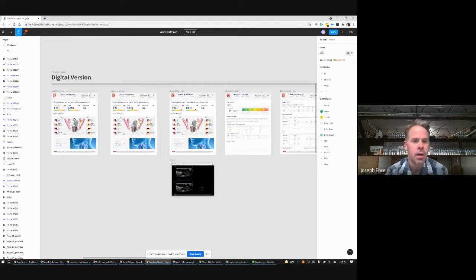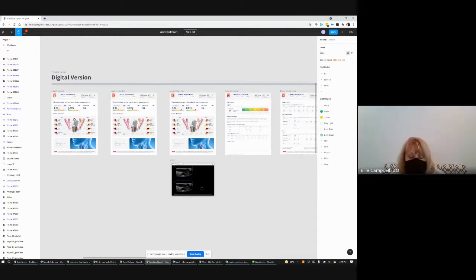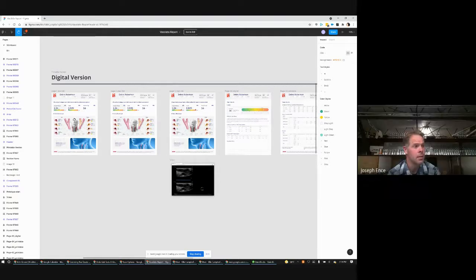If there's a soft pocket in there, it will condense and shrink a bit. But once it's a nugget, they do tend to pancake down quite a bit. You're so happy that you arrested it that people just watch the IMT once the plaque is looking calcified. But the IMTs will shrink. Yes, I know of no lower bound.